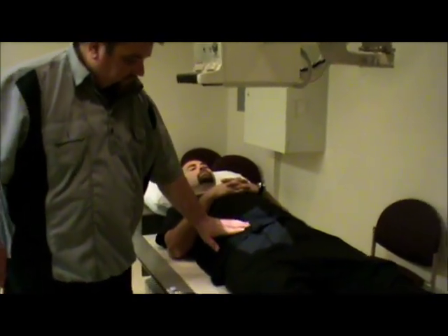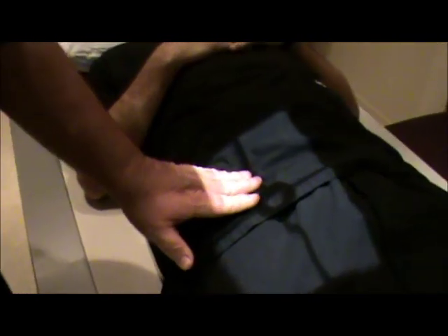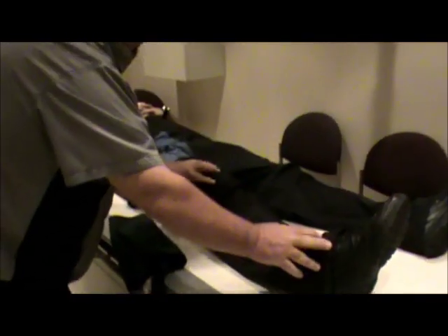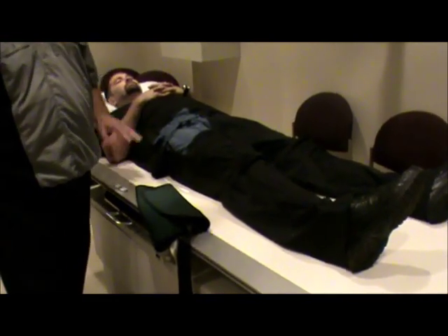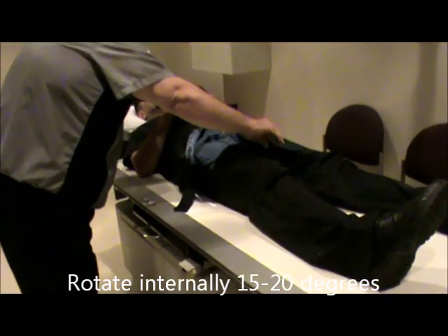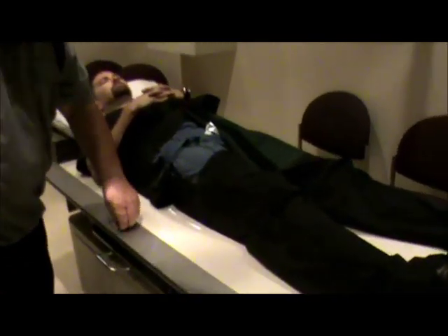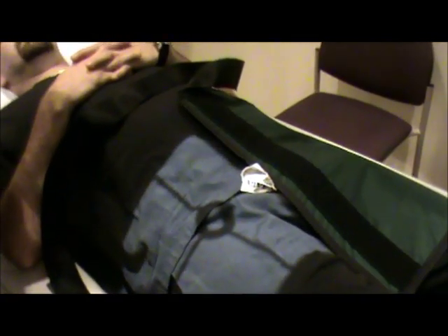We're center-locked and centered to our film. As far as centering, we're going to palpate the ASIS — it's going to be one to two inches in and then three to four inches down. What we do need to do with the leg again is internally rotate it, if the patient can do this, 15 to 20 degrees. We are going to shield the opposite side. As far as marker placement, you have room on the film in the light field to the side to get your marker placement in. Internally rotating shows the greater trochanter in profile.